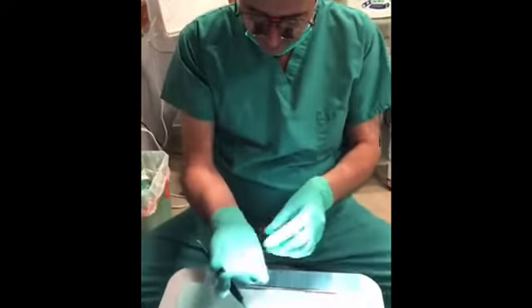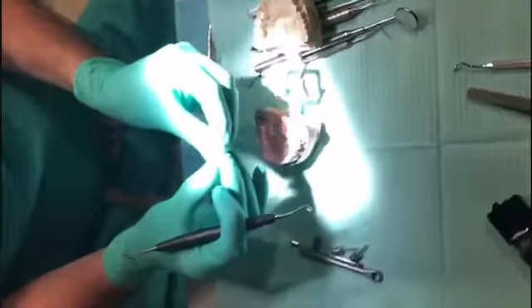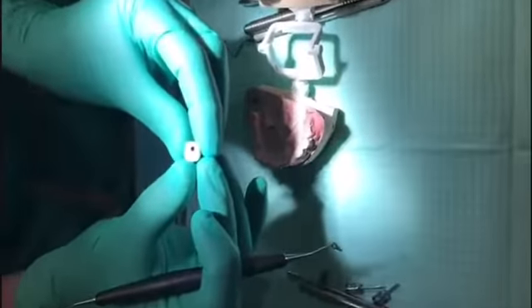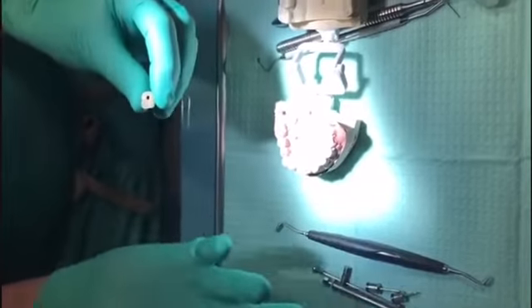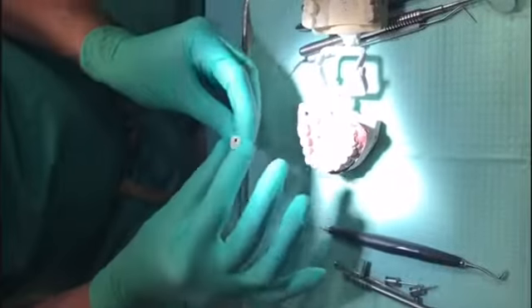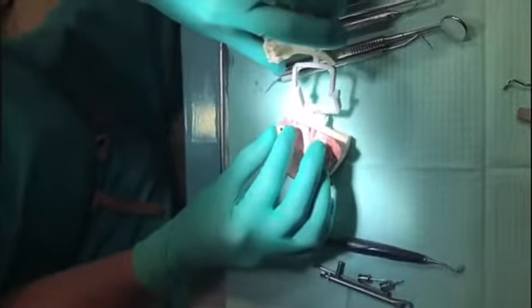Today we have a screw-retained implant crown, and as you guys well know there's an access opening on it. Sometimes when we insert abutments and/or crowns, it's difficult to reach all the way in the back in some cases to negotiate the soft tissue — it's just a little bit difficult.